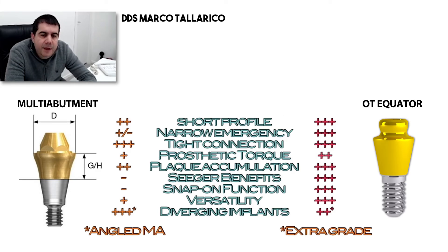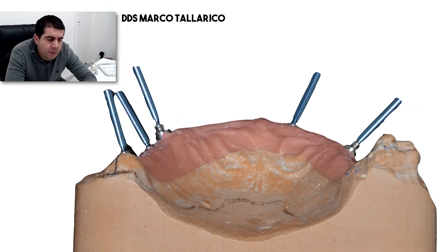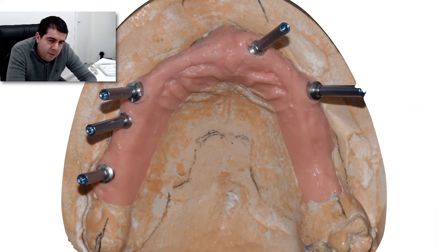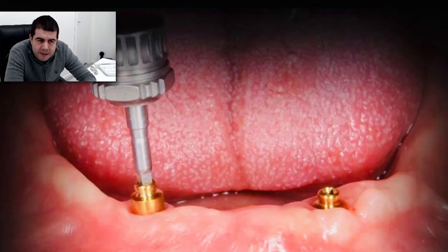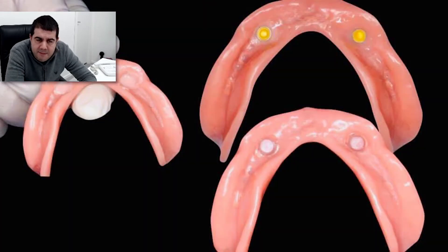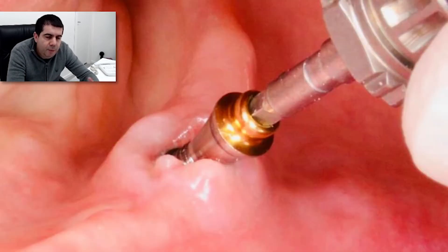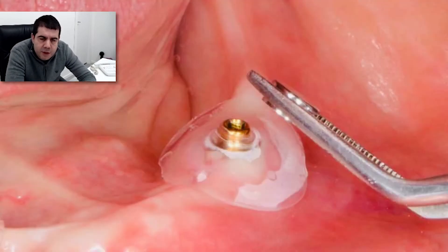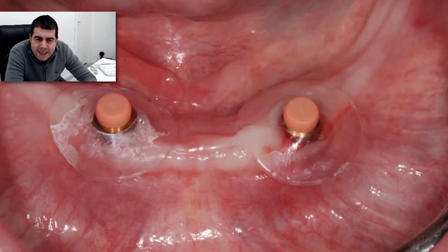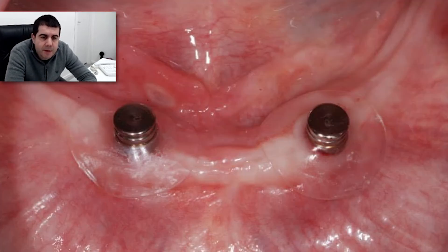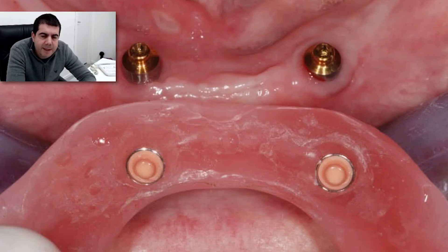Versatility is a really important advantage. Each multi-unit abutment is available with a straight profile or two angulated profiles for severe implant divergence cases, but they can only be used as fixed restoration solutions. The OT equator abutment allows correction of up to 85 degrees of divergence using the same component. It can also be used in implant-retained overdenture treatments, adapting to all implant platforms, diameters, and connections — allowing switching from fixed to removable restorations and vice versa, including provisional temporary solutions.